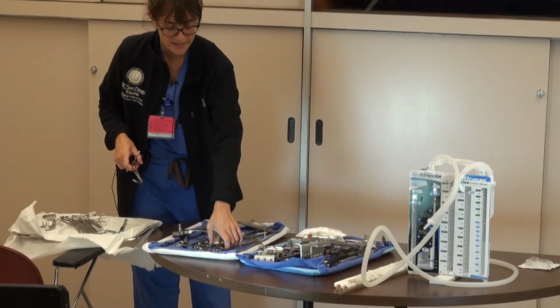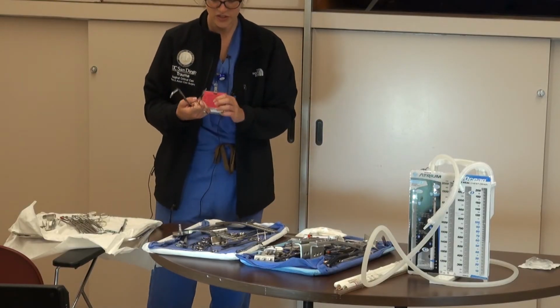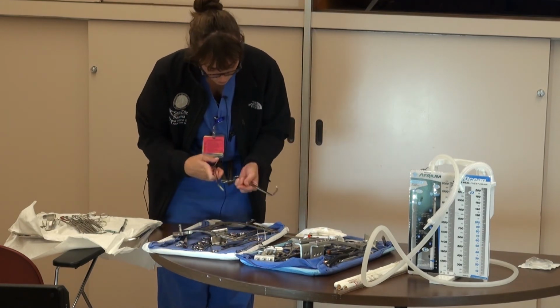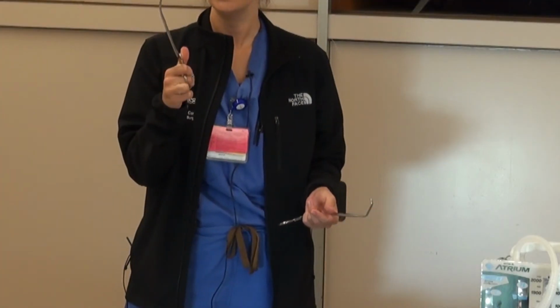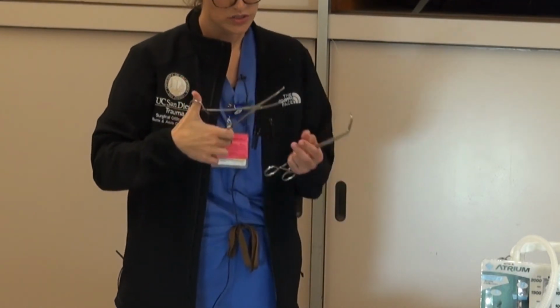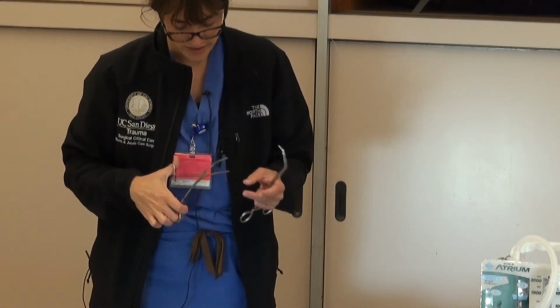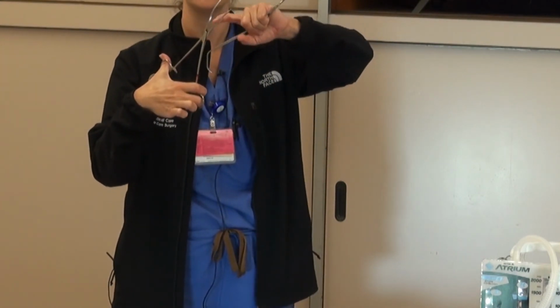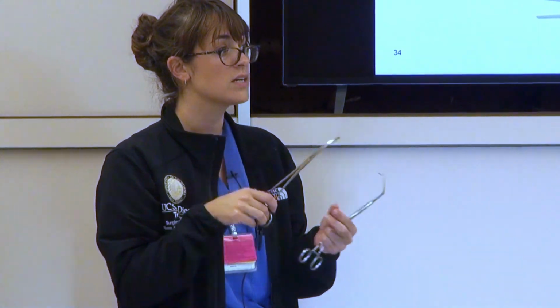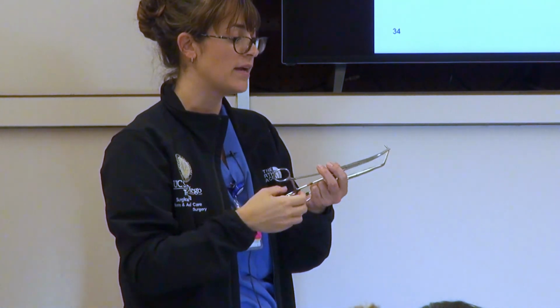So how do you get to the aorta? There are things you need to get to the aorta. You have a couple of different things in here. One, you need something that can dissect. So this is a large hemostat. This one actually is truly a DeBakey clamp, so it's smooth on the inside, so it won't tear the aorta. But you can use this to dissect, because what they're trying to do is get an opening above and below the aorta right against the spine.